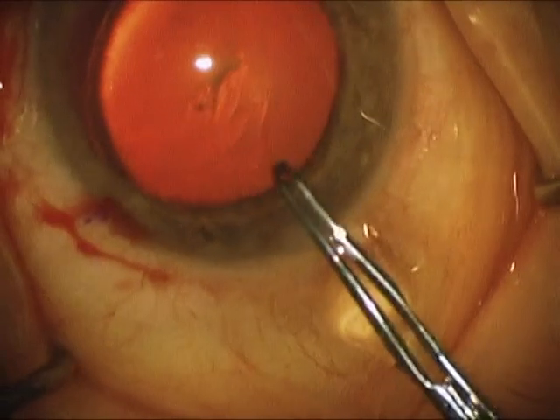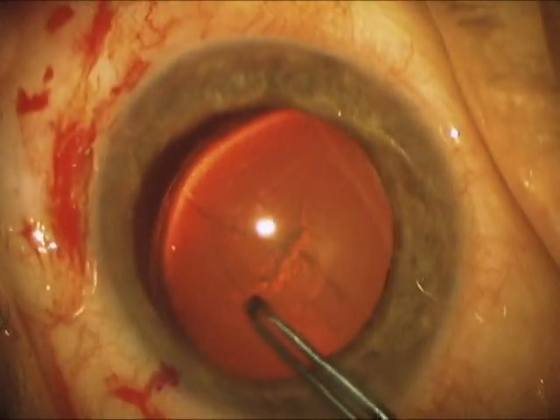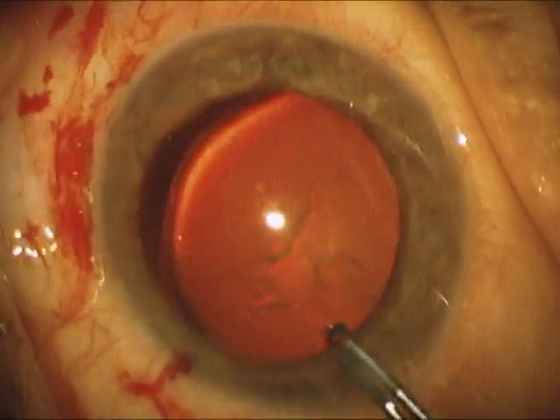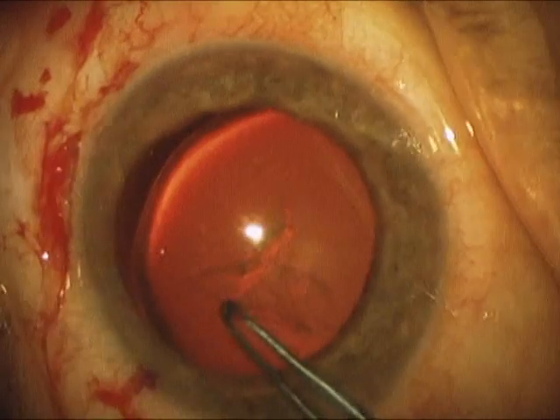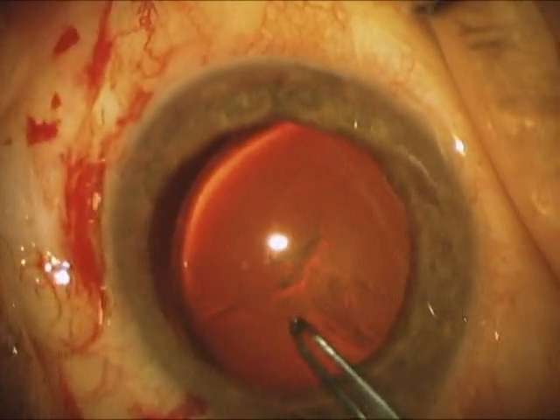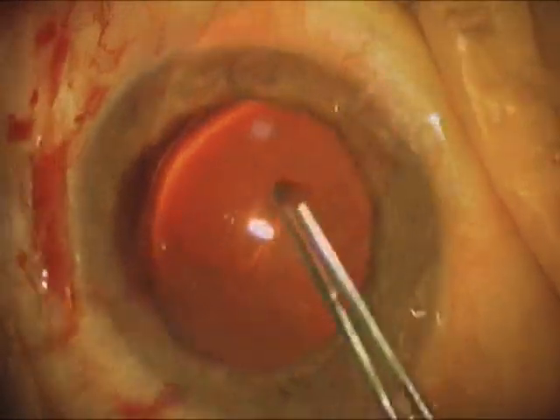Here we're doing the capsular rhexis. You can see it goes pretty well. You can see how loose it is over in the area of the missing zonules. The rhexis is a little bit de-centered towards the area of the missing zonules, which we'll attend to later, but it is a continuous rhexis.